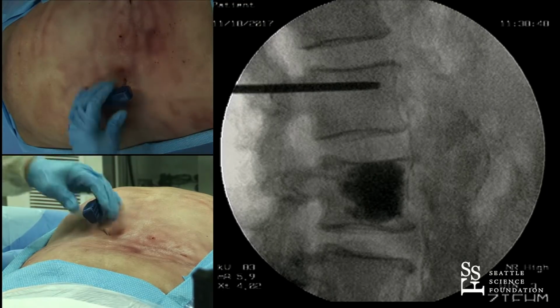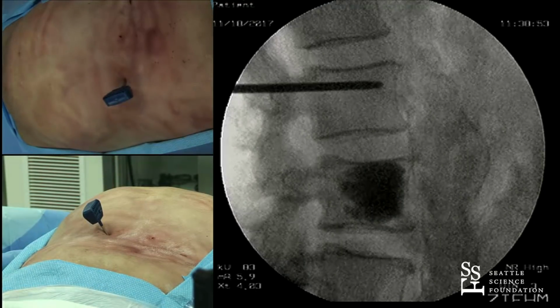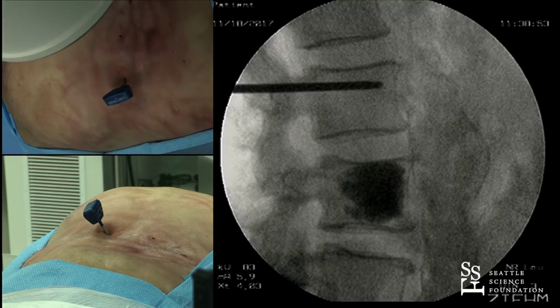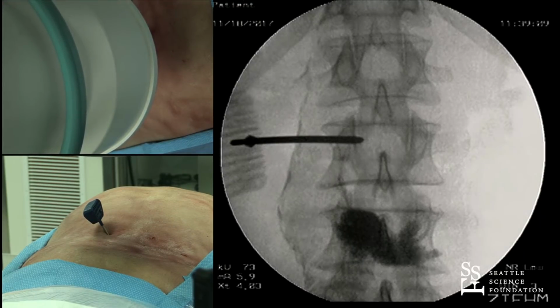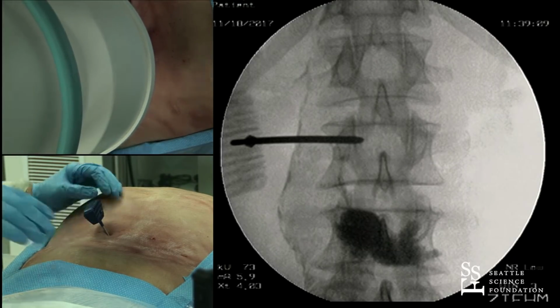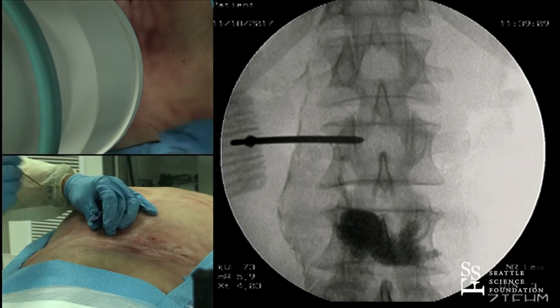And what we're going to do at this point in time is I'm going to go back directly AP and check the medial lateral position. The old saying, the enemy of good is better, is only said by people who can't do better. So you can do better. Good. So this is the kind of area where exactly, if you can imagine the coil starting in this position going medially, that's exactly where we want to be. So we'll change it out.